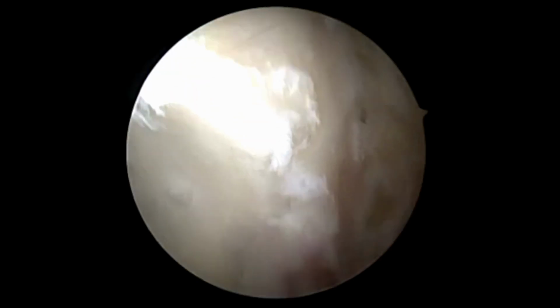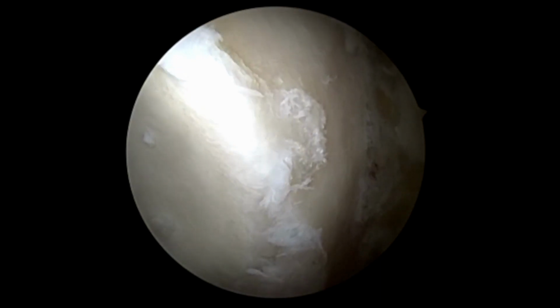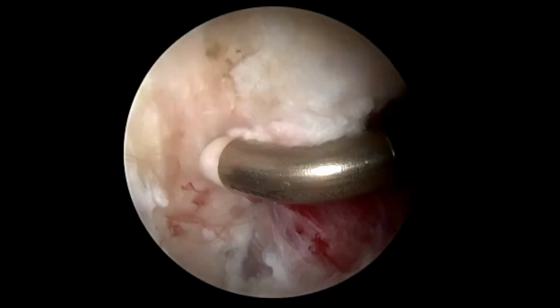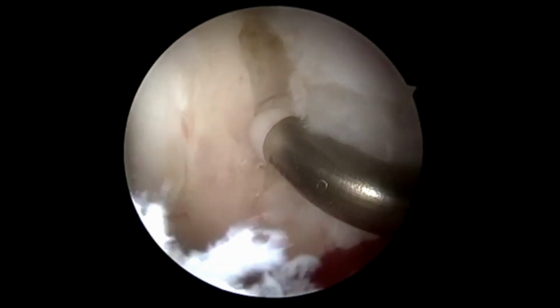We perform rim trimming using a 5.5 mm cylindrical burr, starting with an anterolateral viewing portal to prepare the anterior acetabular rim, and finishing with a modified mid-anterior viewing portal to remove the pincer deformity as it extends superiorly. In the present patient, the labral ossification was so extensive that it required a larger capsulotomy extending to the 9 o'clock position from our standard 12 o'clock position. Rim trimming of the ossification extended from 3 to 9 o'clock.